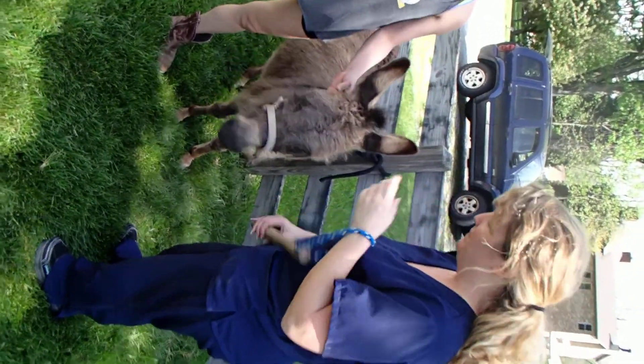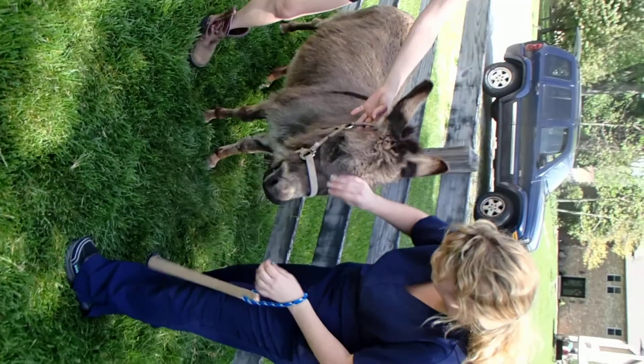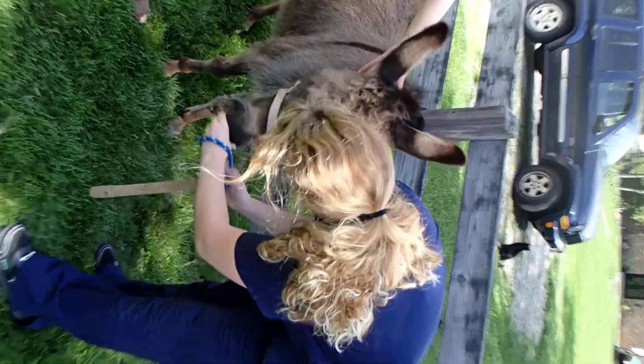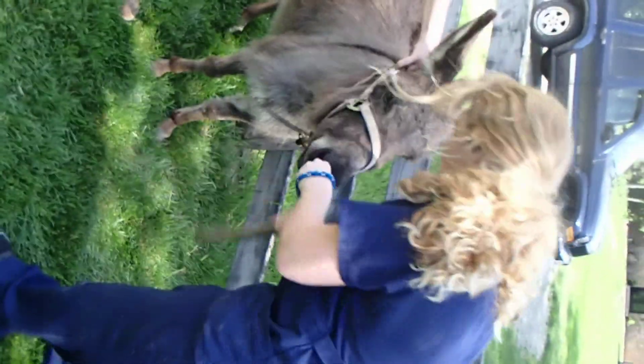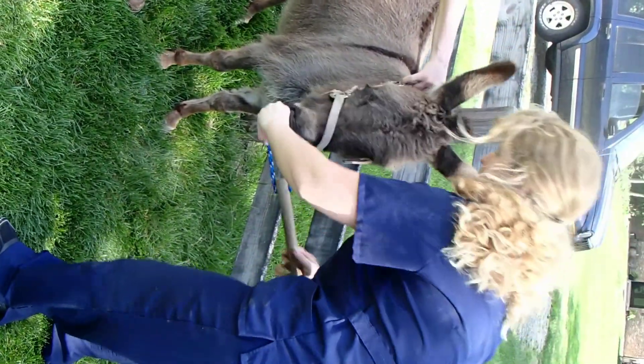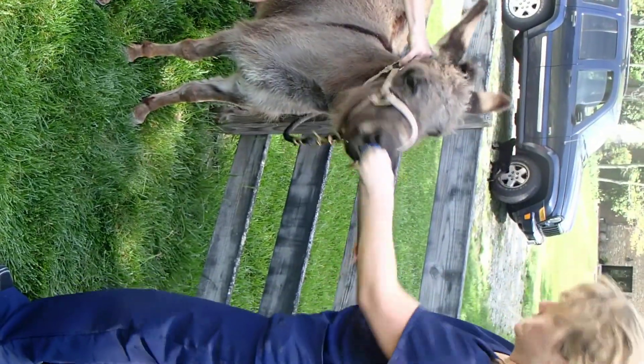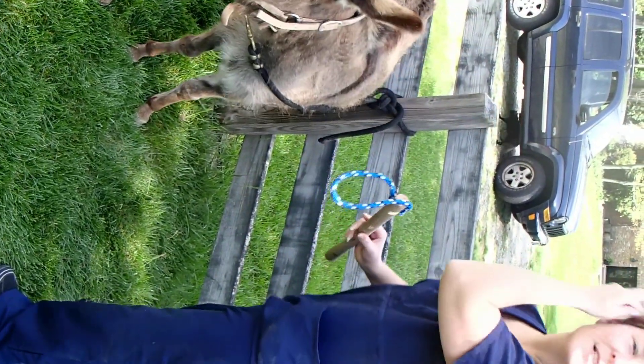You want to come up to them and put your hand through it. You want to take the tissue of their lip here, under their gum. Make sure you don't block their nostrils, and then you're going to twist it on and off to get them to behave.